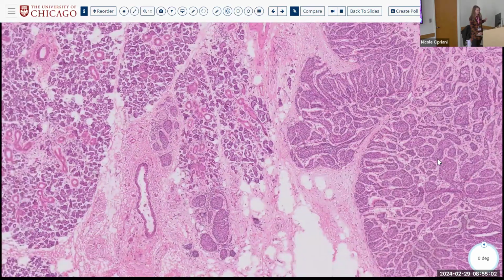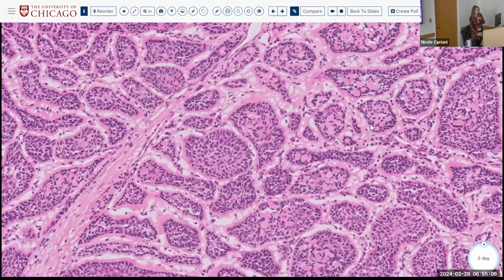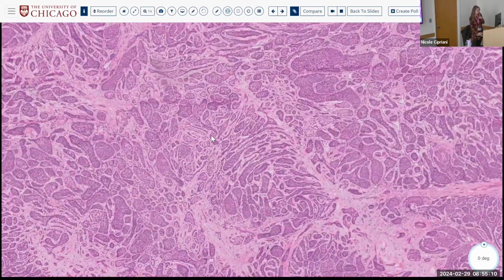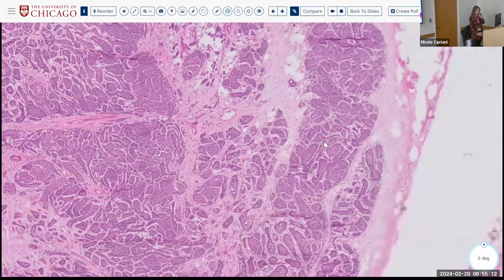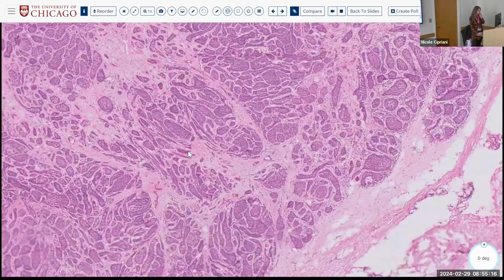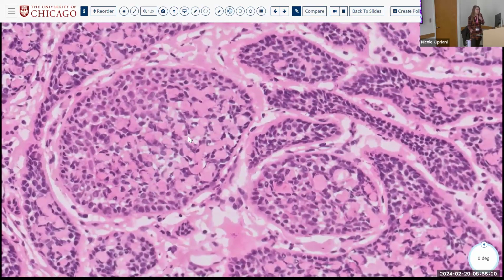Otherwise, the epithelial and myoepithelial islands with hyaline bands are exactly the same. So the pitfall here is that one may interpret these spaces as cribriform, and so this was actually called adenoid cystic on frozen. But we know better. It's not. It's a basal cell neoplasm.